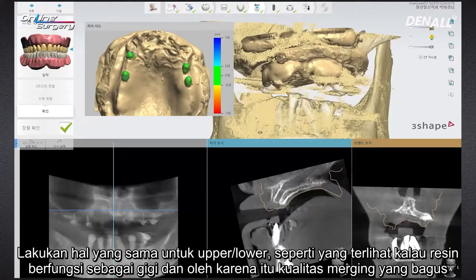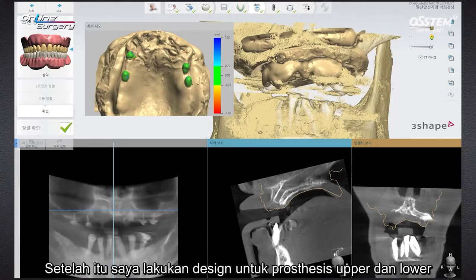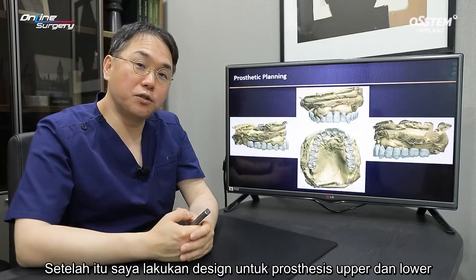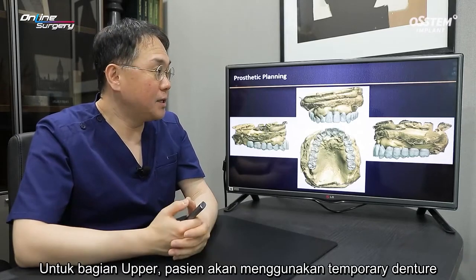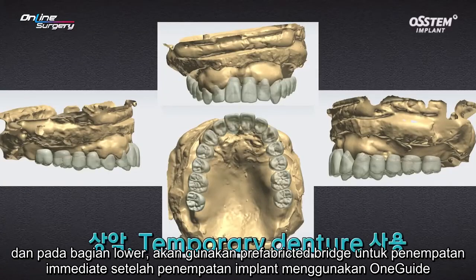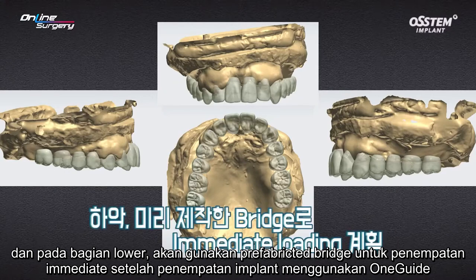The resin ball serves as the role of teeth, and therefore the quality of merging is very good. Merging has been done very nicely for both upper and lower. After that, I designed the prosthesis for the upper and lower. For the upper, the patient was going to use a temporary denture, and for the lower, a prefabricated bridge was going to be used for immediate loading after implant placement using OneGuide.